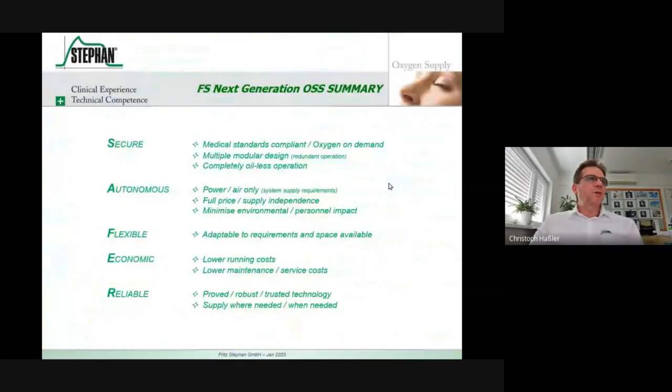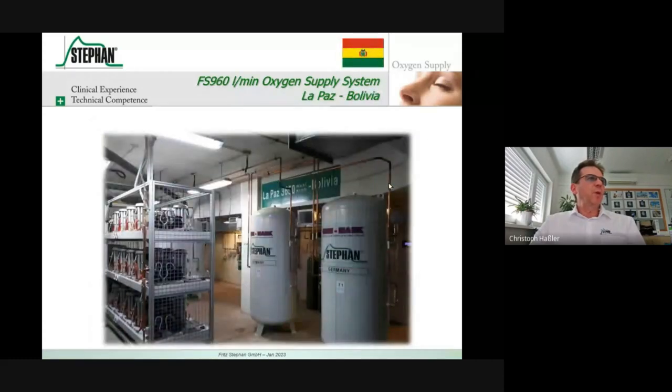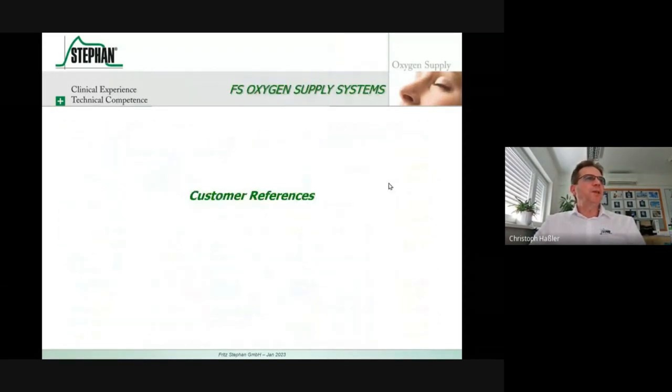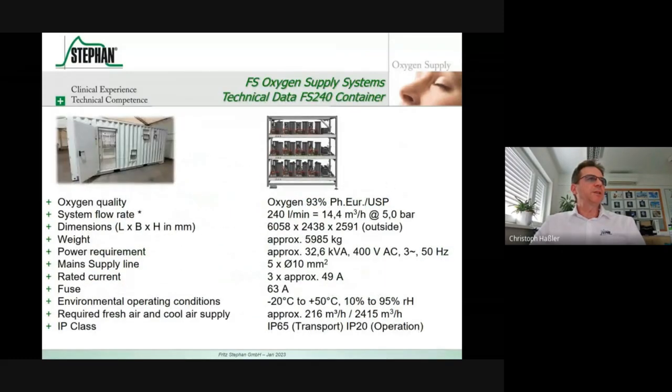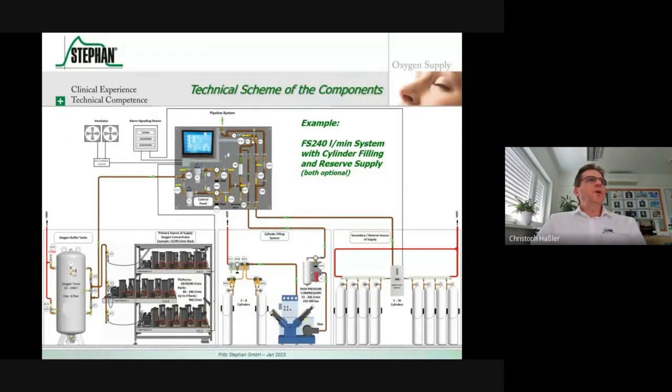Yeah, by sensors, I go back to the slide where you can see that this is done by sensors. So we have a purely pneumatic switchover. Yeah. So those two are working electronically, and also they can work. We have a pneumatic solution for that. So those are electromagnetic valves. As I said, the reserve is normally open without power. And this one, which comes from the buffer tank, which feeds normally the hospital, is normally closed without power. So on power outages, those will not get power, and automatically the failover to the reserve supply will happen.